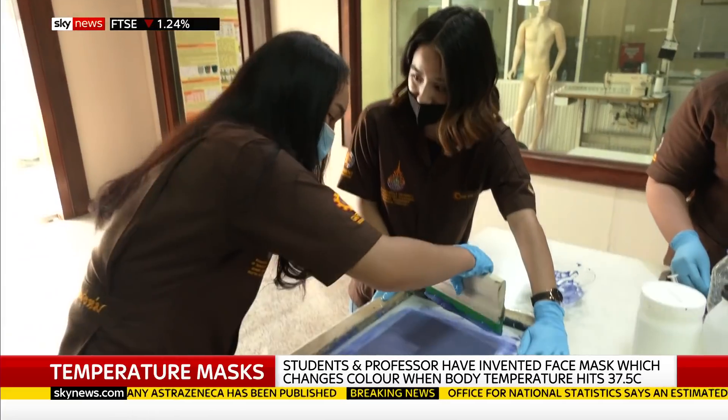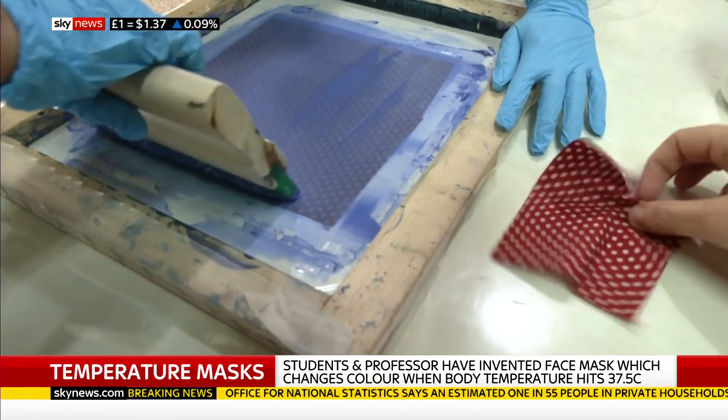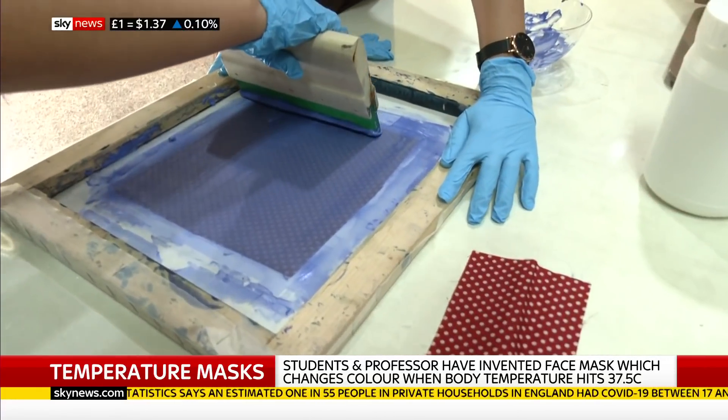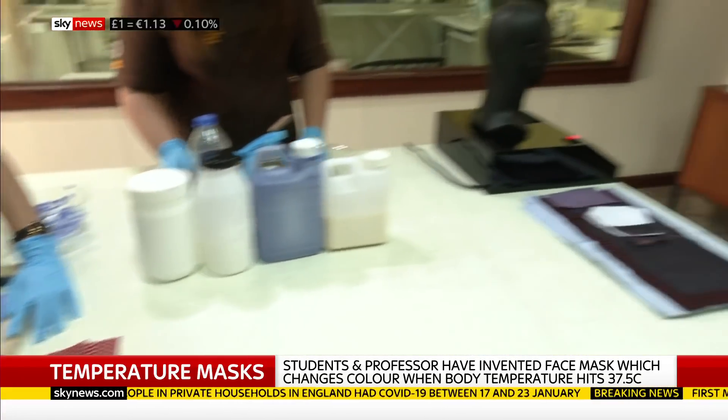Here we've got them putting on the second, that special thermochromic coating. What happens is the original material would be like this — red and white. They then put this coating on in two layers and dry it. And that really is the magic of this mask.